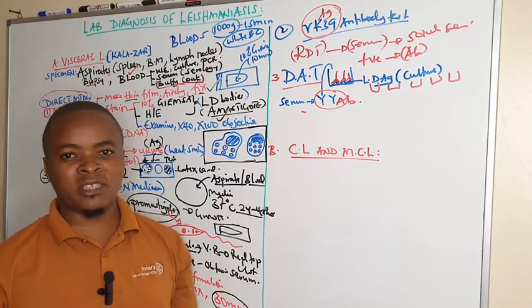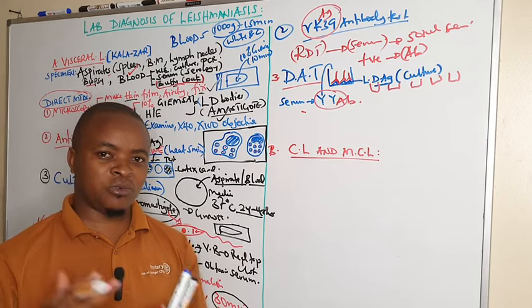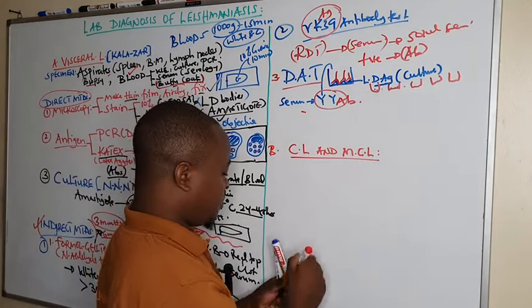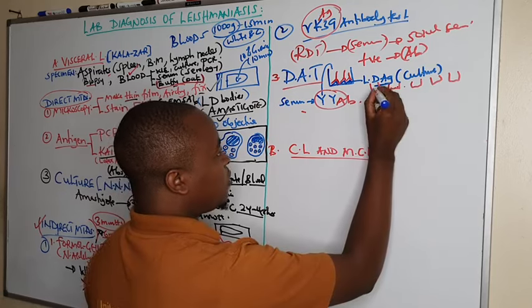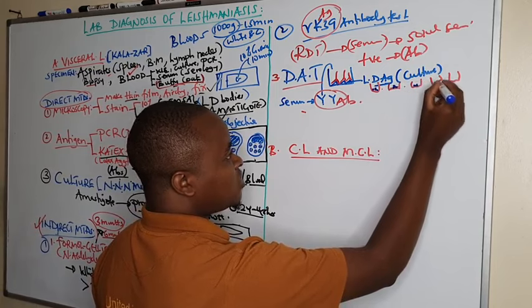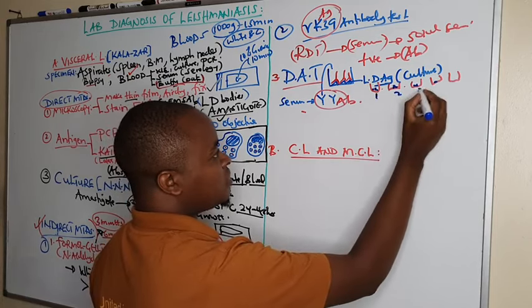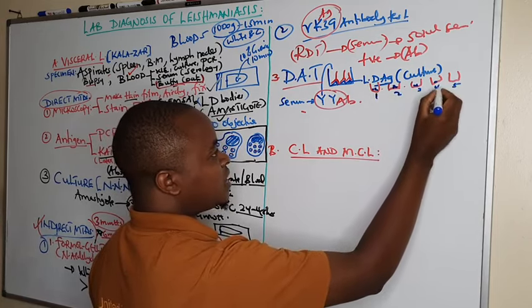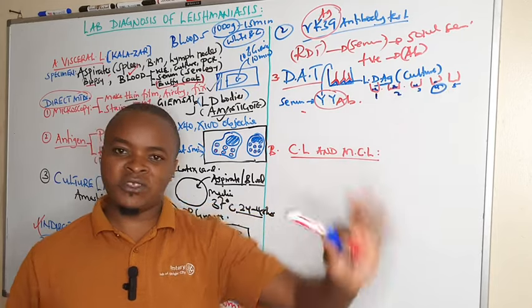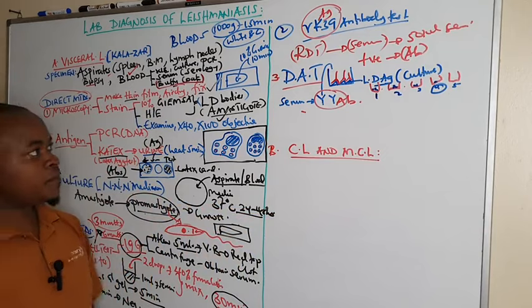And you look for presence of a blue bottom, because we use a stain which is blue in color. So you look for the formation of blue color. If here there was the blue color at the bottom, and the intensity continues reducing, and you find it has stopped here. This is 1, 2, 3, 4, 5. So the titer, we shall take this one, because it is the last one which is agglutination, which is visible. That is under direct agglutination test.